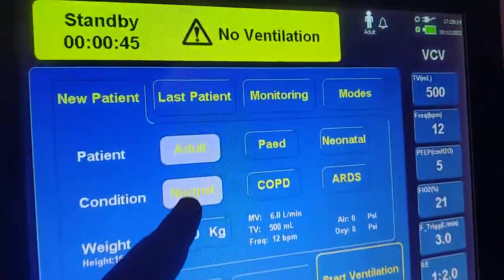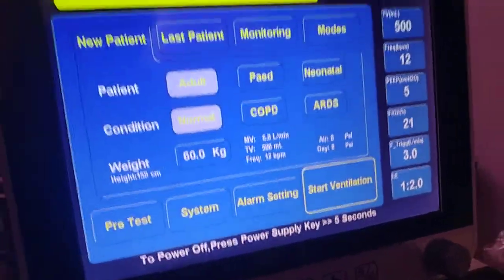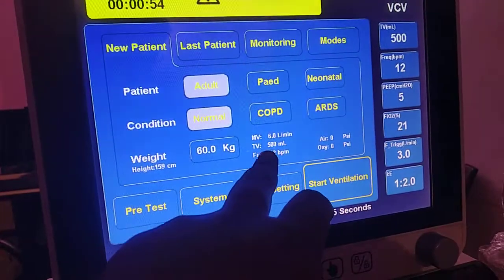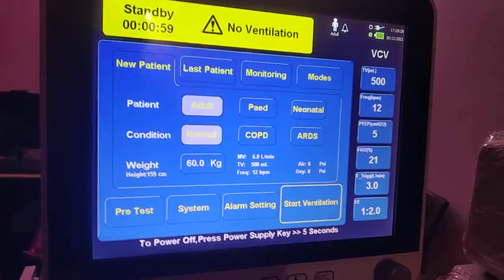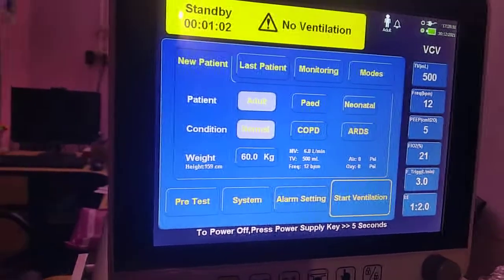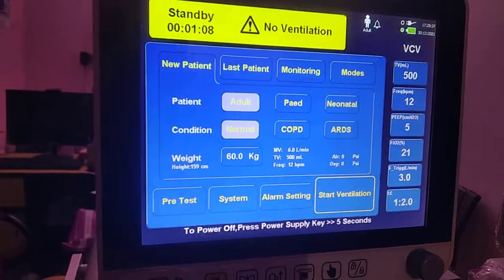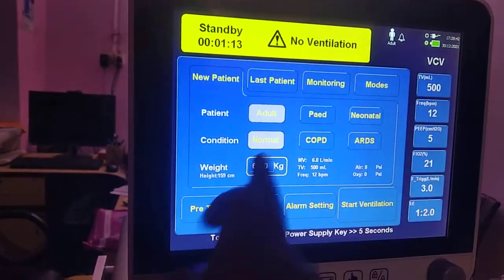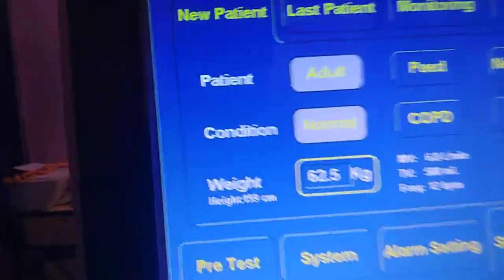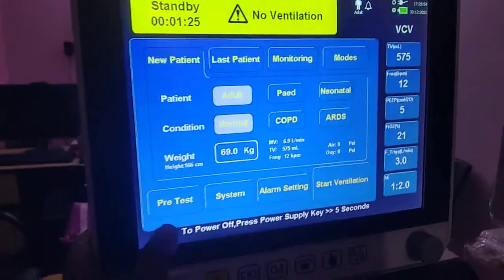You can select the lung type: Normal, COPD, or ARDS. If you select the lung type, the ventilator will automatically adjust parameters according to the lung condition — ARDS requires very low tidal volumes whereas COPD sometimes requires higher volumes. We will discuss this in a later video. You can also enter the patient's body weight, and it will automatically set ventilation parameters accordingly.